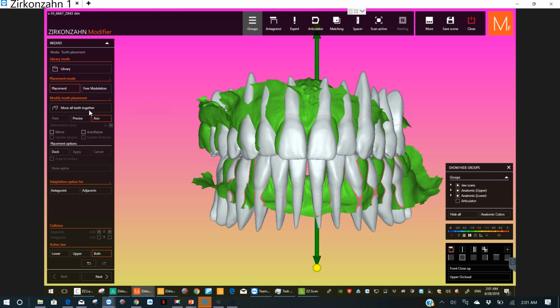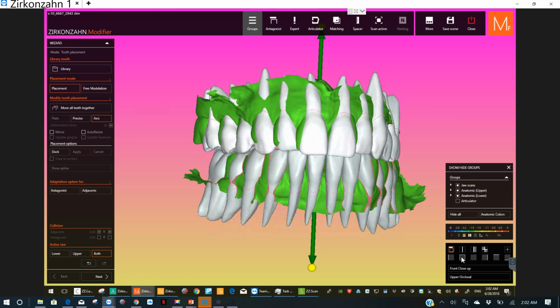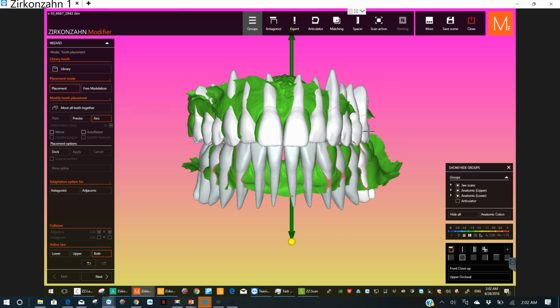Oh, this was placement. So when you don't have "move all teeth together," then it doesn't slide the whole thing around, and you can grab little areas, and it'll leave the bite nice for you. So watch how easy it is to increase your curve of Spee if you want to. And I caution doing this because you're trying to blend it into their crappy arch. Just trust where the teeth are. It's probably going to be more level. Okay, maybe a little length.